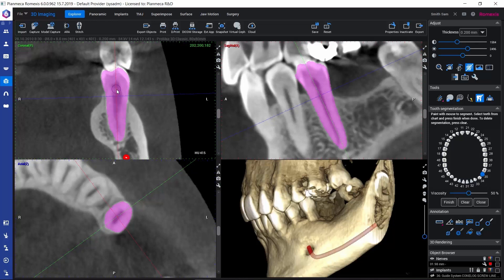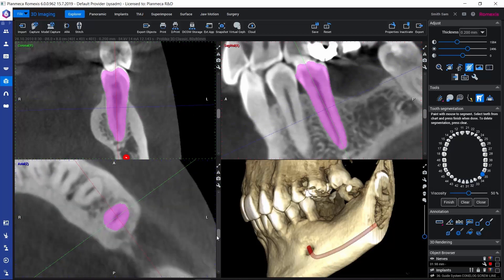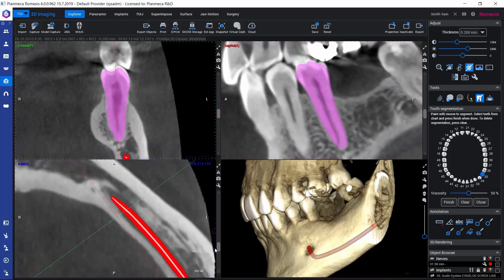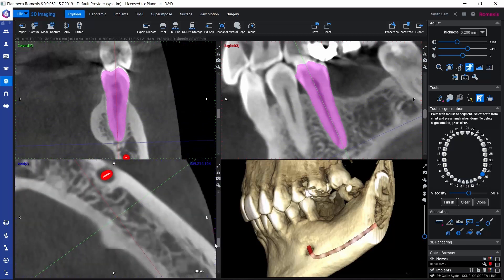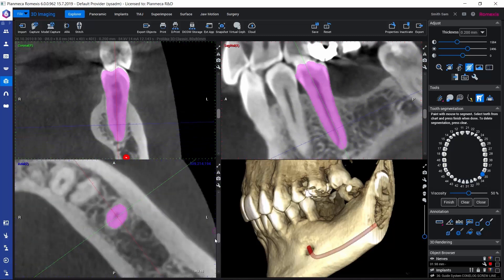We can also resize the tool cursor by keeping ALT down on the keyboard and using our mouse wheel, so we can paint or remove finer details as well. After painting the tooth in the sagittal and coronal views, we can still use the axial view for verifying that the paint is covering all the root of the tooth.